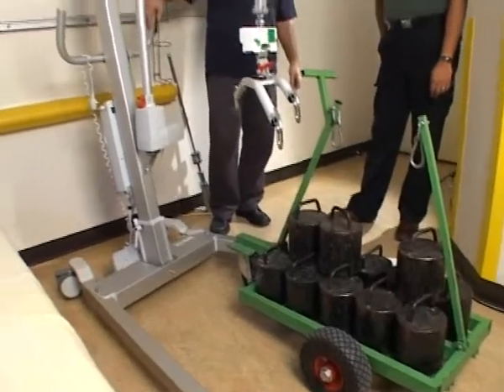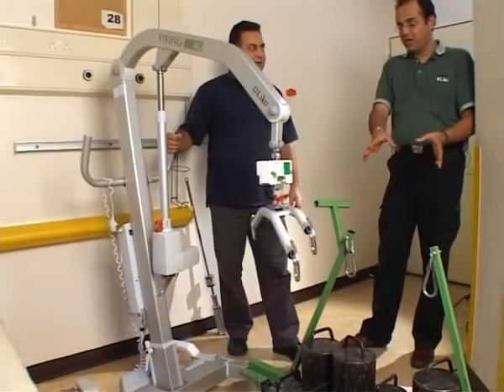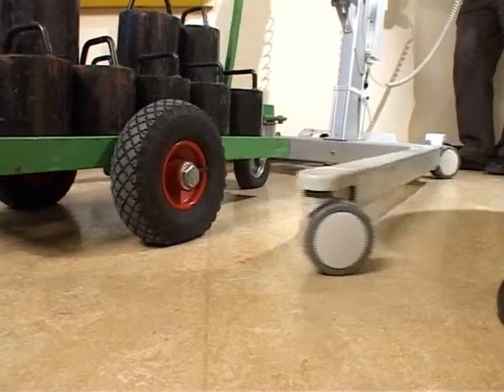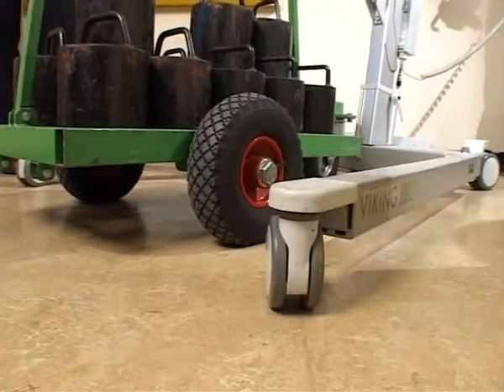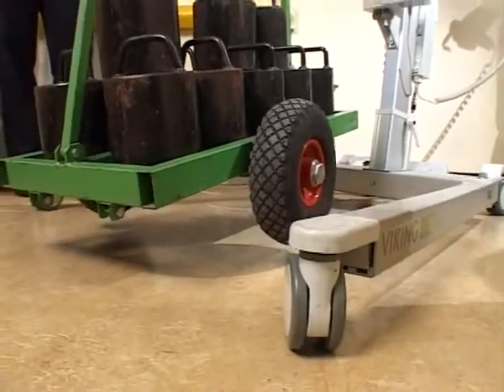Rakesh, can you explain to me what we're going to be doing with the hoist? So what I'm going to do is a load test using the scales. By using these weights, which have a total mass of 300 kilograms, I'm going to raise the weights off the floor. And I've noticed that when you pull the weights up, the hoist pulls itself to the centre of gravity.